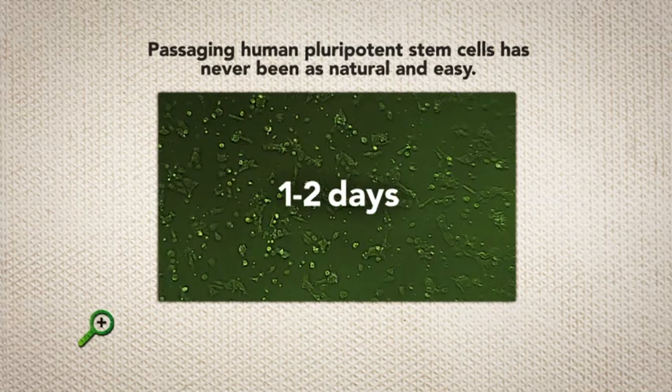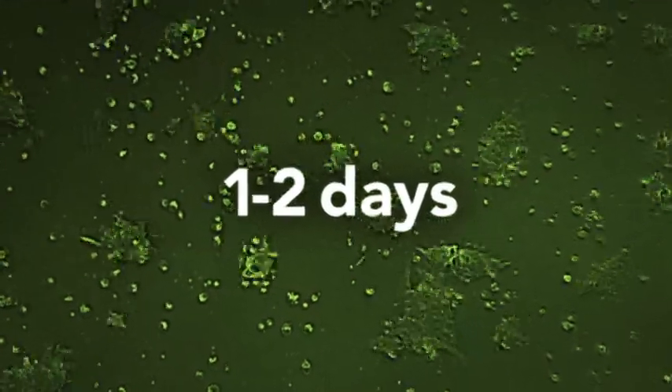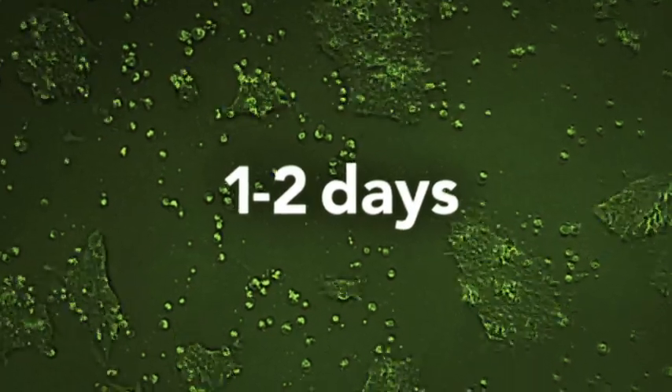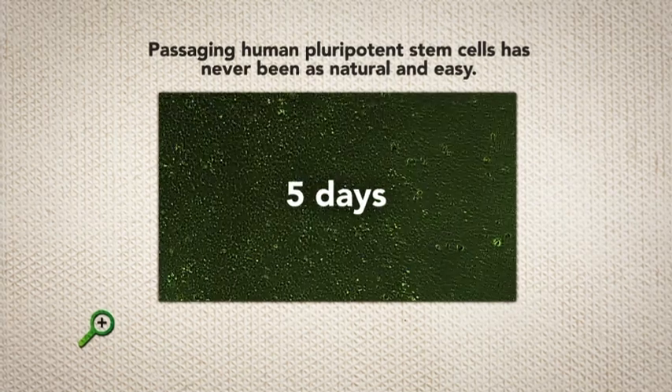Single cell suspension passage using BioLamina's human recombinant laminin 521 is a defined, animal protein-free and novel method that allows for automated high-throughput human ES and iPS cell culturing. Passaging human pluripotent stem cells has never been as natural and easy.